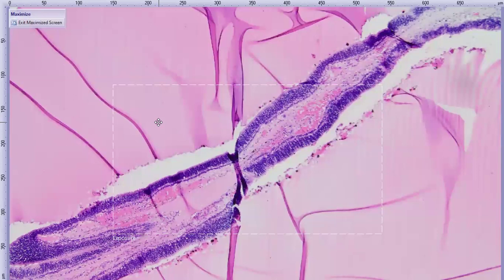So hyperviscosity syndrome, increasing the protein contents of the blood, causes it to be kind of a sluggish, denser blood. There's a higher tendency for coagulation, a decreased vascular perfusion throughout the tissues. And what we're seeing here, the decreased vascular perfusion caused the hemorrhage and necrosis, and then it starts bleeding, but there's so much protein that protein exudates inside the globe and kind of congeals, causing the retinal detachment, etc.